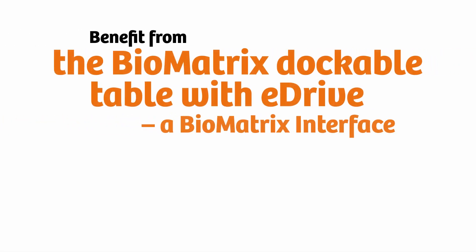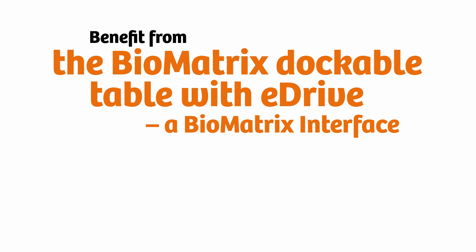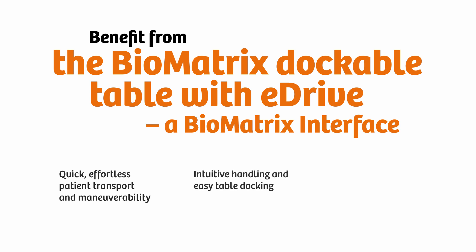The Biomatrix dockable table with eDrive benefits you and your patients with quick, effortless patient transport and maneuverability to and from the scanner. With eDrive and fifth wheel support, intuitive handling with touch recognition, easy table docking with auto docking, as well as simplified patient repositioning with a minimum table height of 56 centimeters.